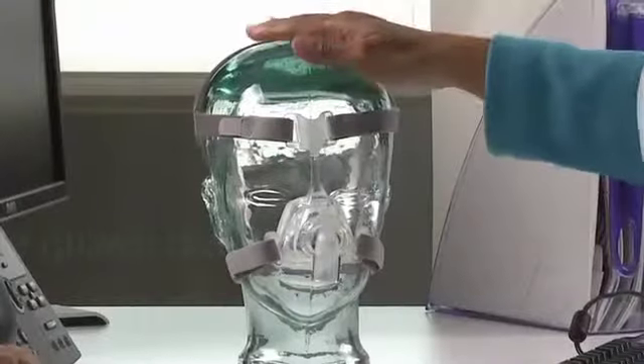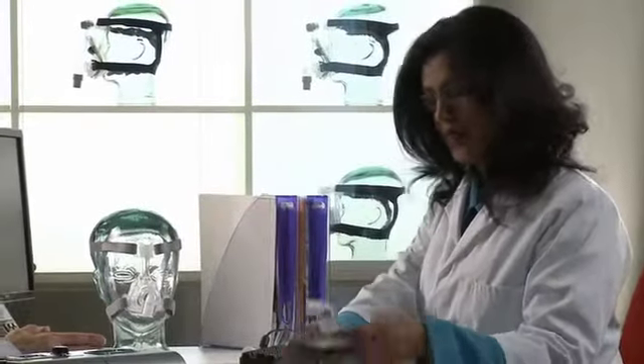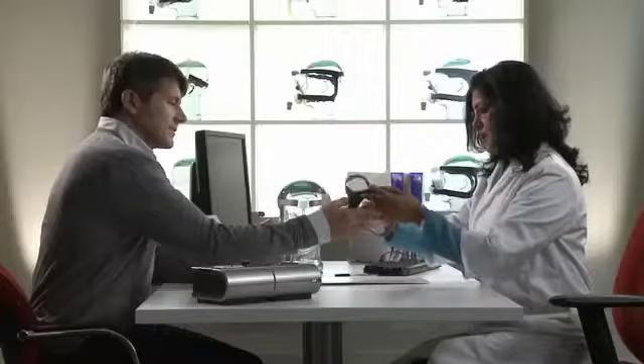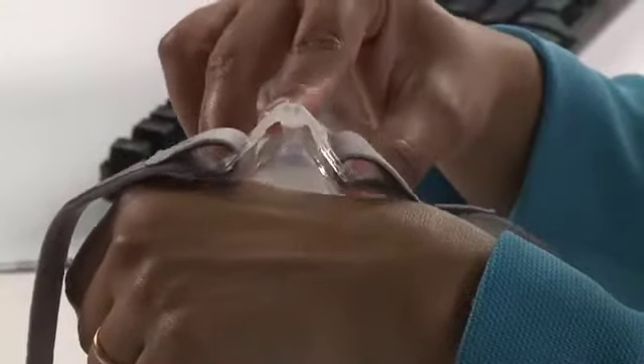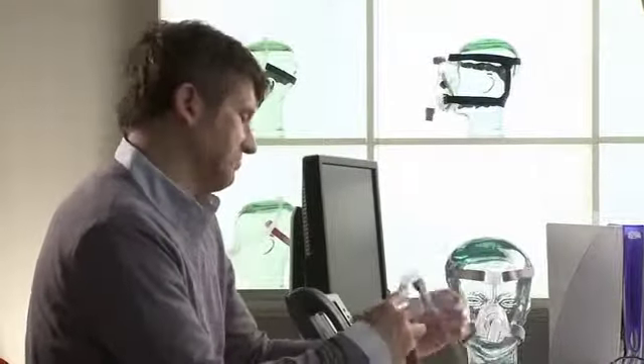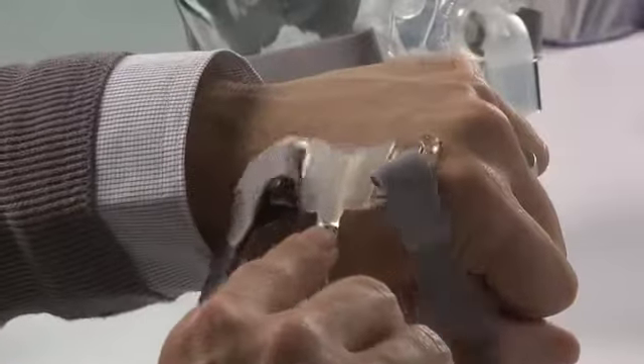Fitting is effortless and effective. Mirage Effects is intuitive to fit and adjust, so fitting takes virtually no time at all. With its flexible winged forehead support, the Mirage Effects moves with the patient, providing greater adjustability of seal and comfort without the fuss.